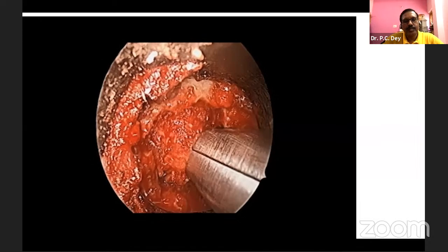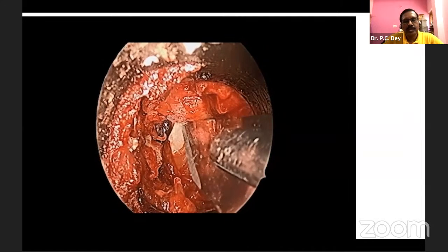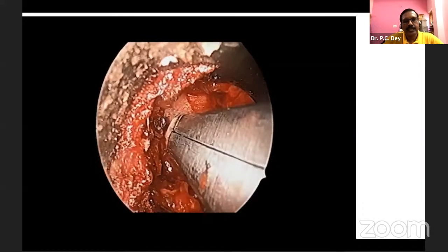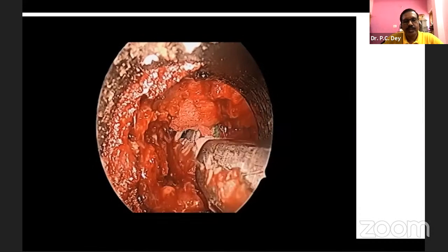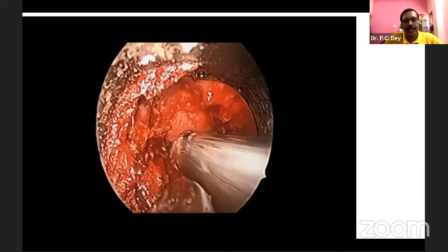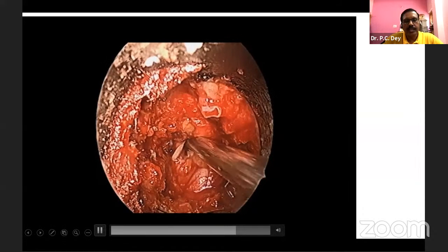So this is the foraminal disc. Just approach from the posterior aspect, not interlaminar, but directly the extraforaminal area, and this is your disc. So with the versatility of the instrument, you can approach the foraminal disc also very easily and comfortably, and remove the disc. And it takes about the same amount of time, as if you are doing it regularly.